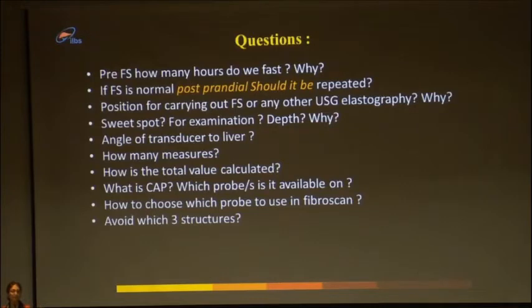Very good. Why do we need a patient to be fasting? And in continuity with that, I'm asking you the second question. Supposing a patient has had his breakfast or food and you carry out a Fibroscan in a postprandial time and the scan is normal. Let's say the elastography is normal. Would you want to repeat this scan or no? No. Very good. Why not?